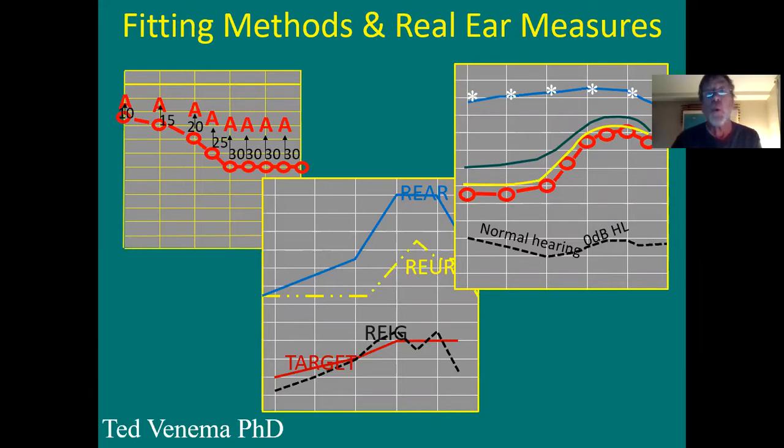Then they take the hearing aid, put it on top of the tube, and have the same sound coming in, and now you get real ear aided response. Real ear unaided response, real ear aided response, the difference between the two, real ear insertion gain. And did you match your target? Were you getting half gain? Today, we go in a different direction.